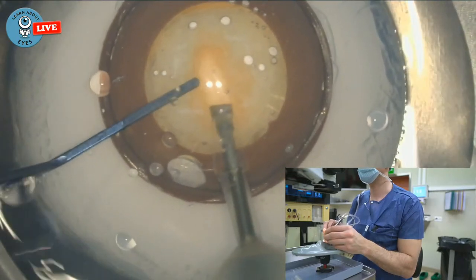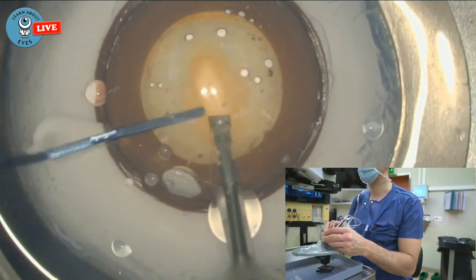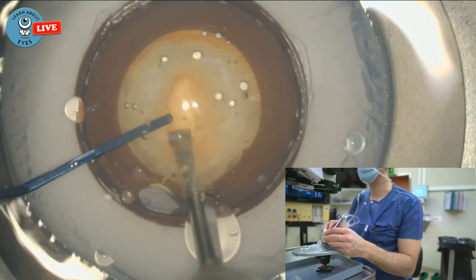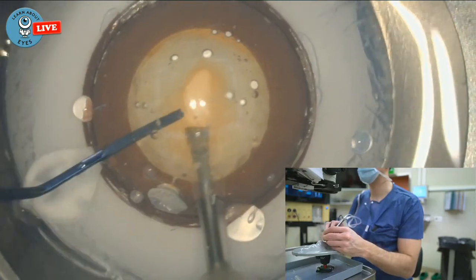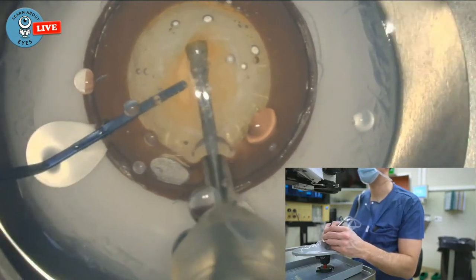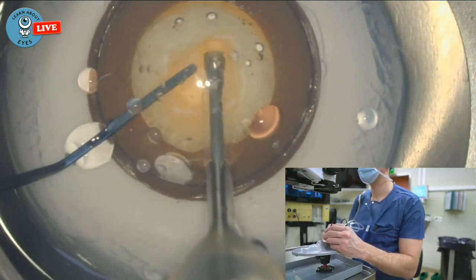So now I've gone through. Now this, of course, you wouldn't go this far through with a real eye, but these are so waxy that you're not able to split them otherwise. Maybe this is not even enough of a groove, but I'll just try. Go in. I usually just adjust a bit, like this. That's too much. And then go in deep and then do your cracking. See, it doesn't work here. Still not enough.